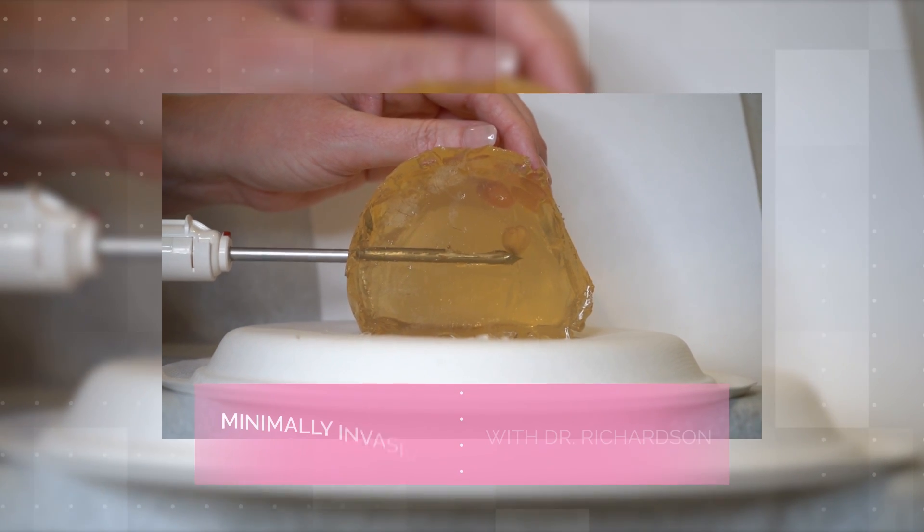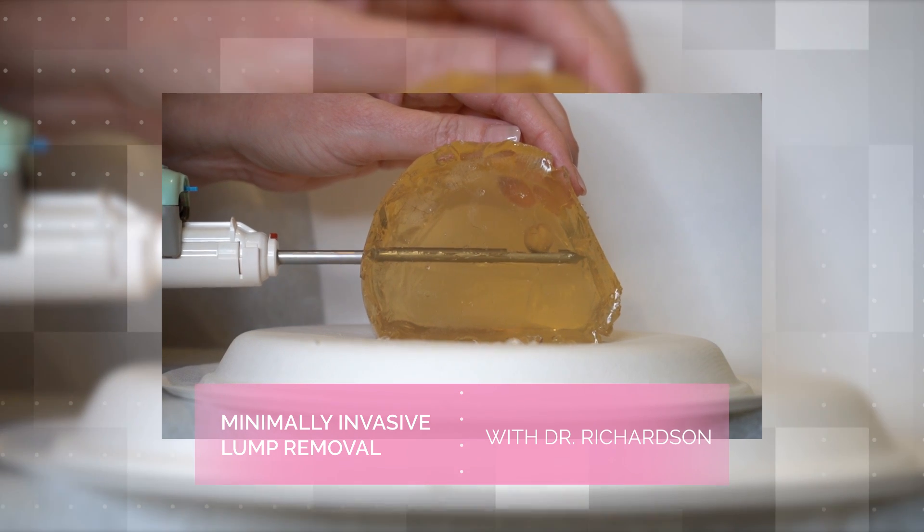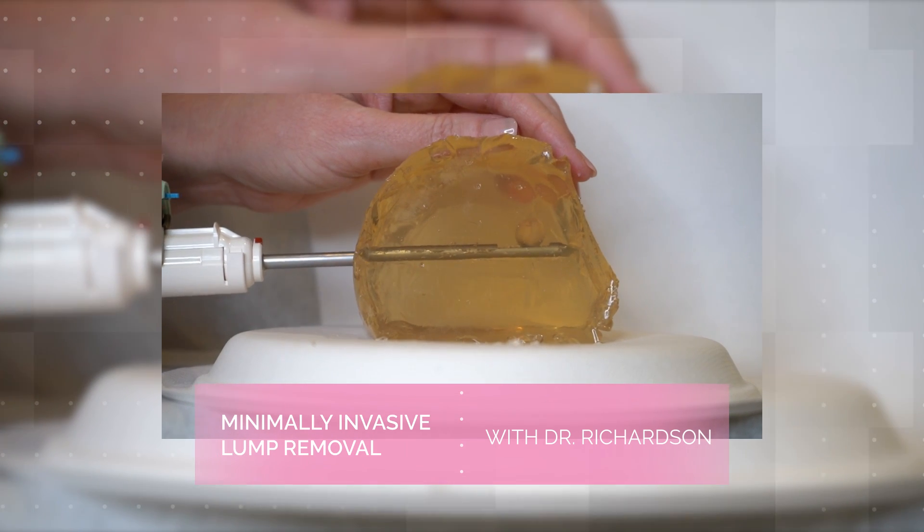Hi, I'm Dr. Heather Richardson from Bedford Breast Center. Today I'd really like to show you something super interesting. We've created some artificial biopsies to demonstrate what happens when we use our minimally invasive technique.